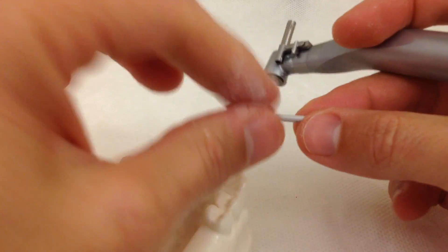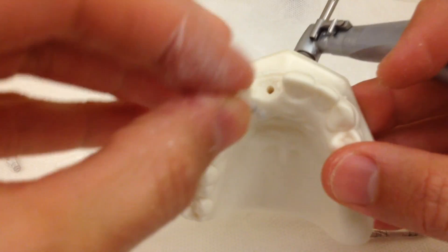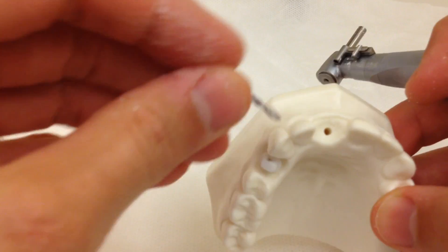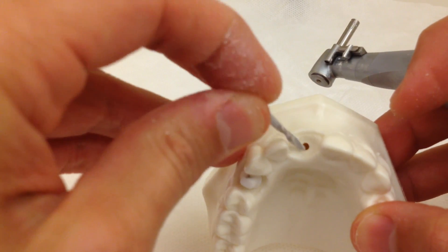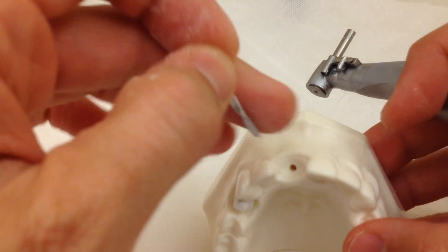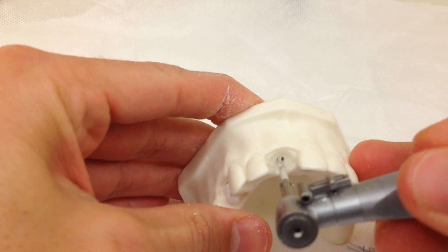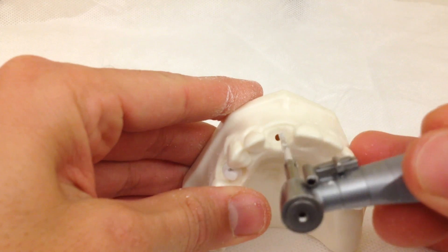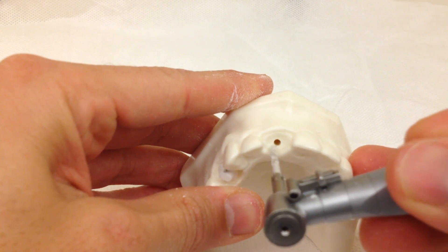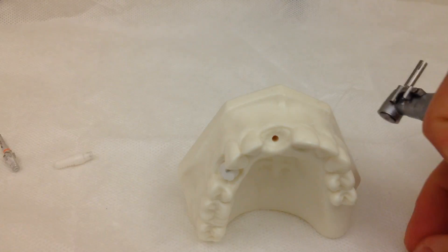This was 2.3; now we're going to go with a 2.8. Every time we increase the diameter, we want to check if we are in the center of the osteotomy. If the osteotomy is not centered, we can still correct it. If we are more palatal, instead of going to the next drill, we place the last drill used and apply more pressure towards the buccal — or more palatally if we need to go that way — whichever side has more available bone. We are in the center, so we're going to go to the next drill: 2.8.